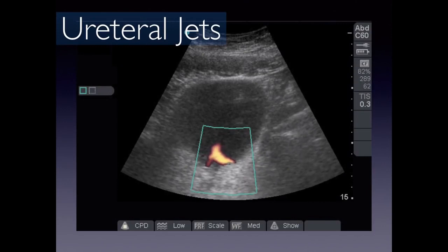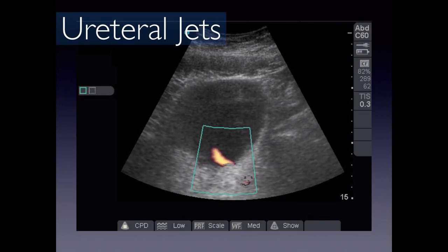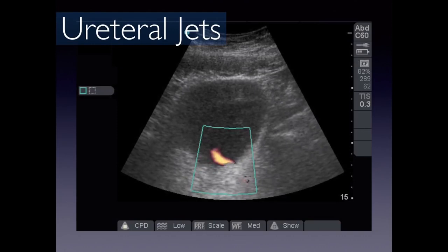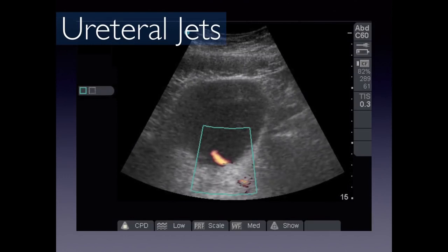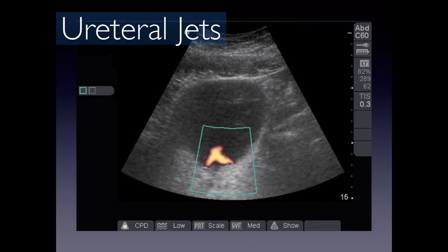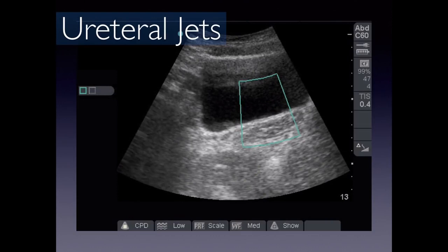Ureteral jets visualize urine flowing from the ureter into the bladder using color power Doppler. Unlike standard color Doppler, power Doppler doesn't show direction but shows flow. Near the trigone, you can see the right ureter jet shooting diagonally toward the left and the left ureter jet shooting toward the right. This confirms the ureters are patent. If there's complete obstruction, you should not see ureteral jets on the affected side.